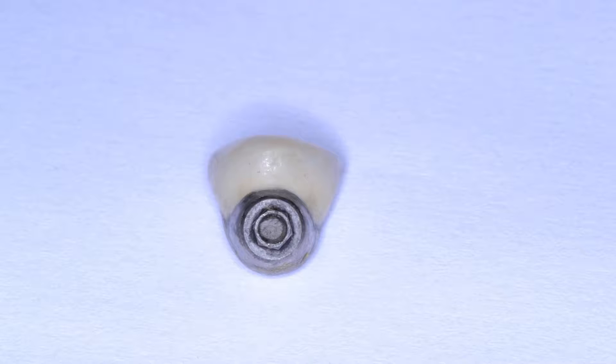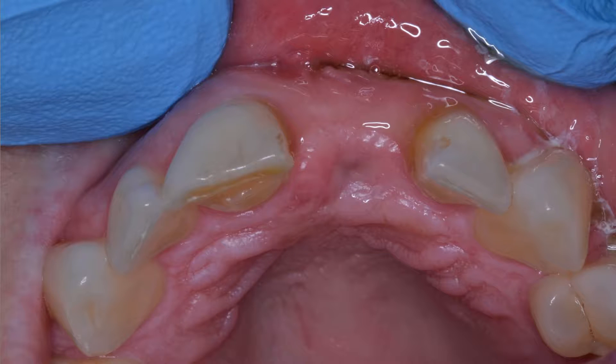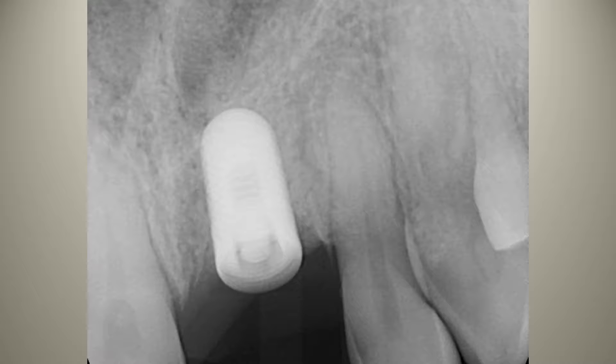Moving to the next picture, you can see that this patient had come in about a week after the tooth had fallen off, and the gingiva has basically grown over the implant screw access to the site. Looking at the next picture, you can see that we drilled into the lingual aspect of the crown and removed the broken segment of the screw. In the radiograph, we want to confirm that there is a broken segment of screw inside the actual implant, and one can also assess the bone levels to ensure that the bone is healthy.